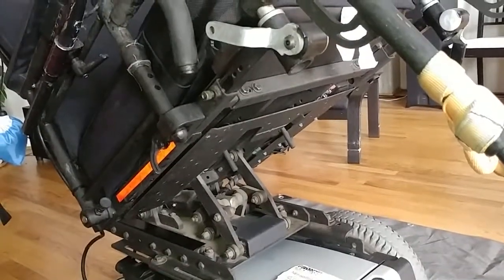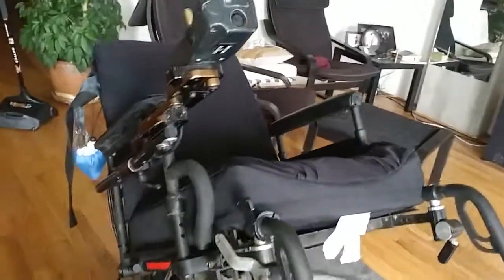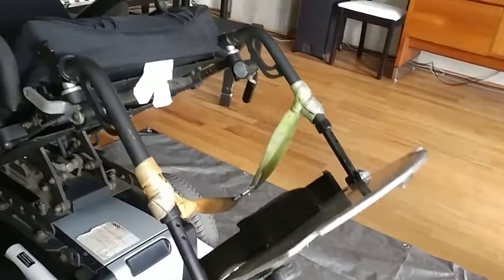I've already refurbished the upper part a little bit. Got new arm pads on, as you see there. They're not all ripped like the other ones were. And yeah, we'll have to rebuild this front end as well, the front riggings.